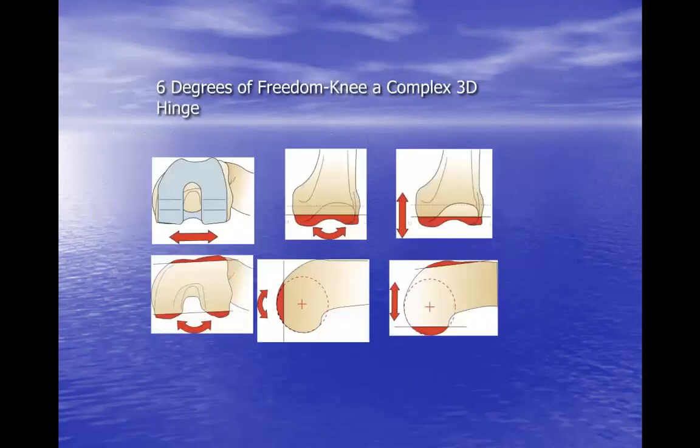We know the 6 degrees of freedom of the knee, all of us know about this. And to do a knee replacement, you need 3 basic cuts: tibia, femur cut, and a patellar cut. If you add these 3 cuts to 6 degrees of freedom, there are 215 ways in which a senior orthopaedic surgeon can get a knee replacement wrong. What to speak of an Ayush doctor doing a knee replacement surgery, to increase the EBITDA for a hospital.